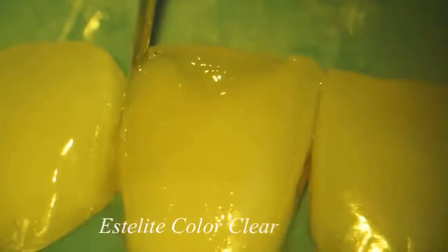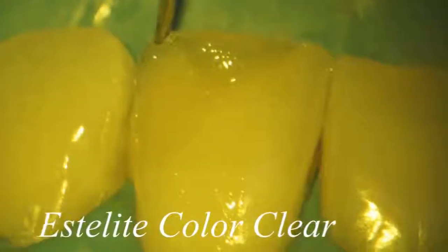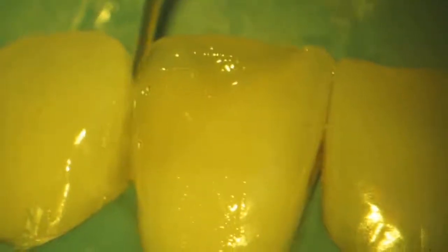In order to fill this slit-like gap between dentin core and distal side wall, I used Estelite Color Clear. This is some kind of flowable translucent composite, which perfectly fits to the elimination of such slit-like gaps.